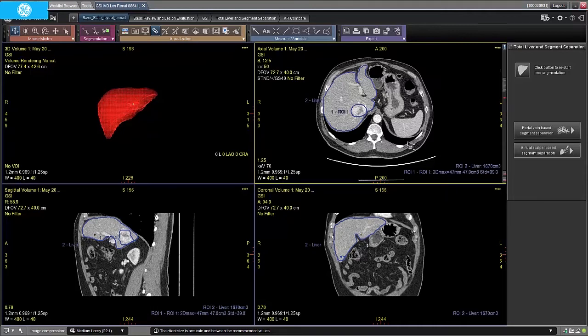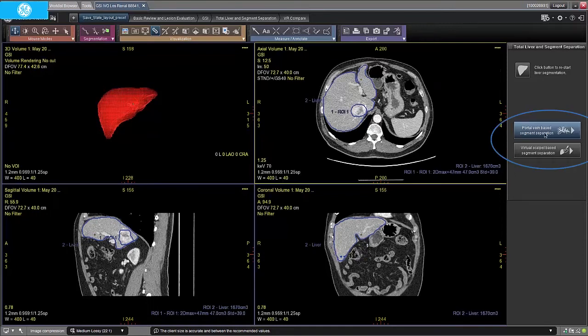After accepting the liver segmentation, the user has the option to continue with the analysis by separating the liver into segments or lobes. Hepathec VCAR provides two methods for this type of segmentation: portal vein based segment separation and virtual scalpel based segment separation.